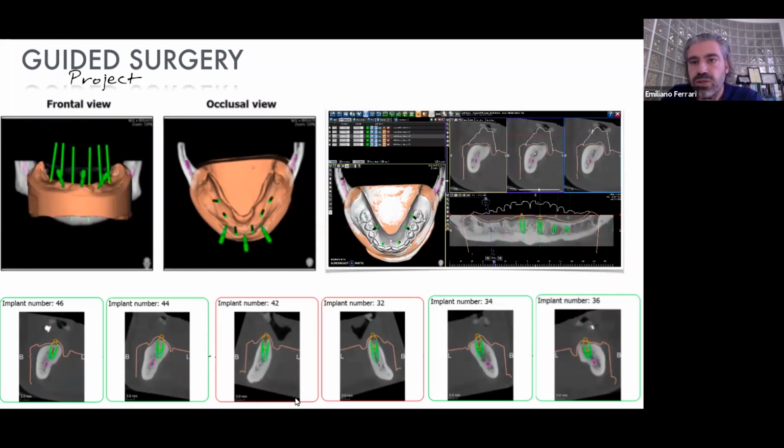42 different equators of different heights. In that way, you have all the different kinds of abutment that maybe you may need after the surgery. Of course, there is a special price for this kit, so it's a help for you to have everything on your own in your office, ready to go.